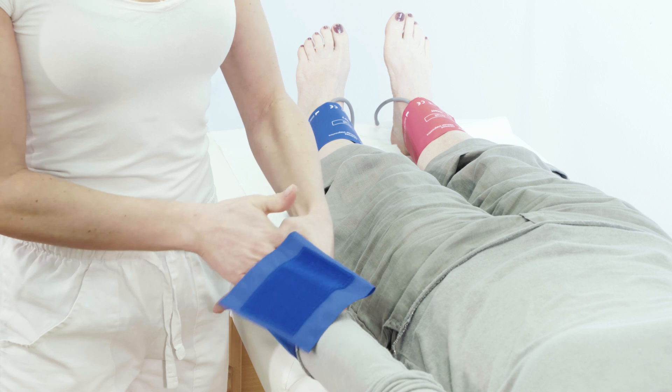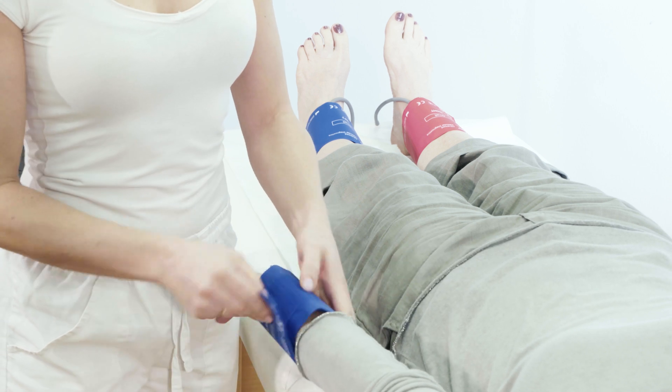As a result, the success of wound healing in diabetics can be assessed.